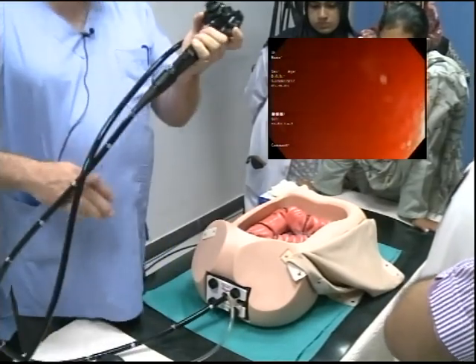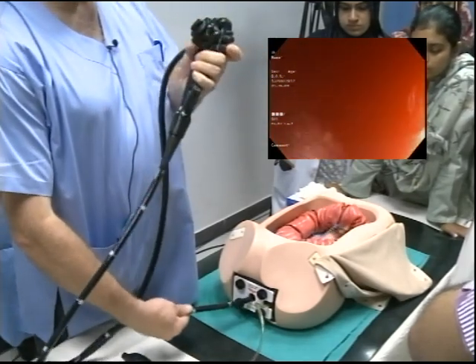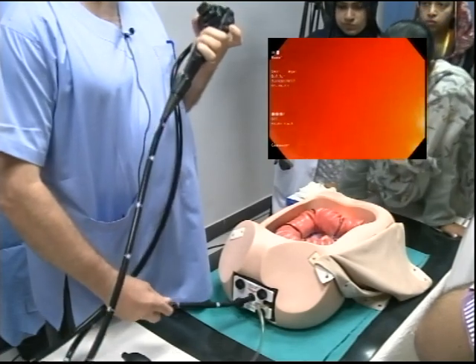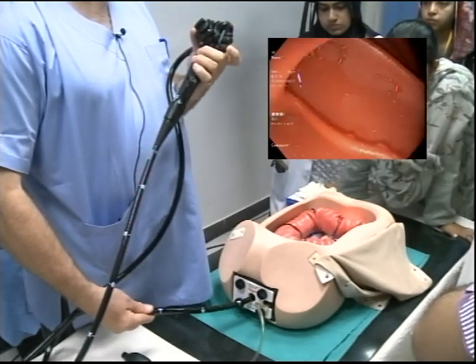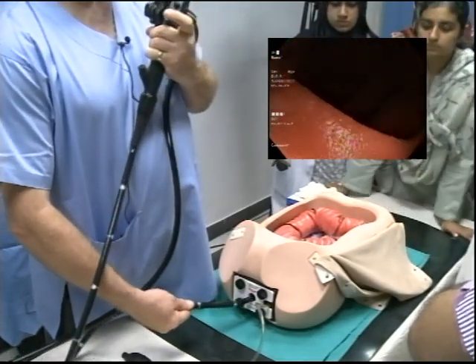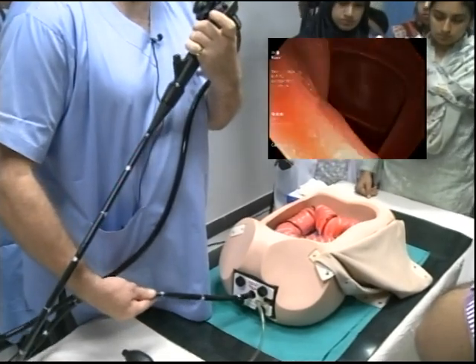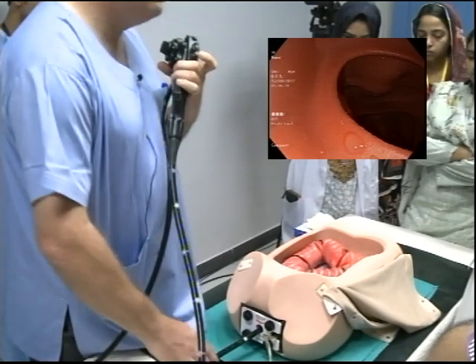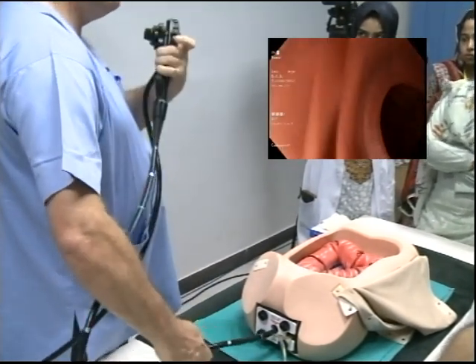And then you'll find that when you actually come up here, the scope will actually start to straighten and then bring it back. As it comes back, you'll see the lumen come into view, then you can go forward. All the time it's go forward, come back, go forward, come back. It's not completely committing to one maneuver or the other.